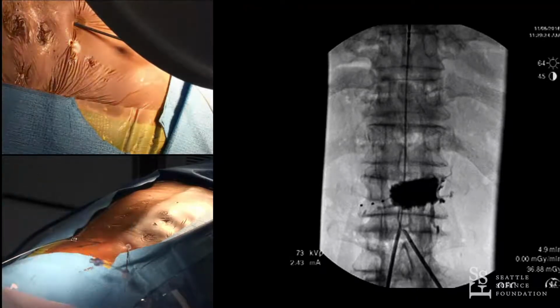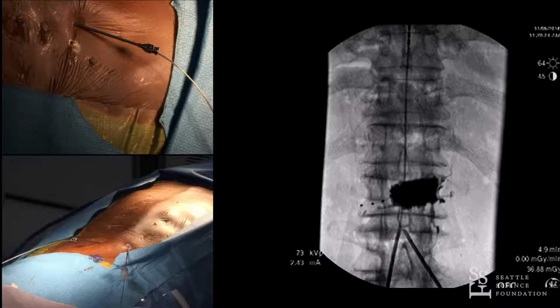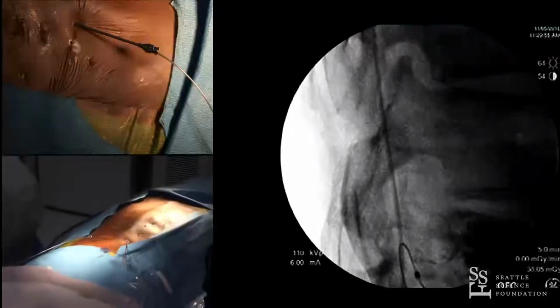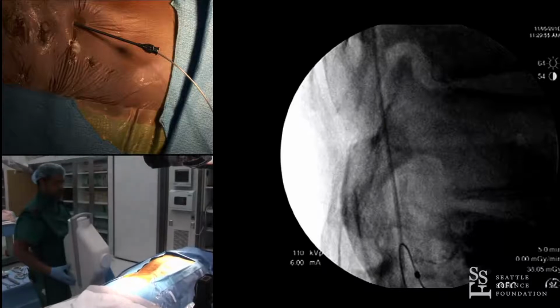Let's take a lateral view now and see what the alignment is of the leads inside of the foramen. Looking to make sure that they are posterior to the vertebral body and that they're aiming more out at us. You can see how, can we mag that, mag 2? Mag again, great, thank you. Come south, please. Tad bit more. Right, there you go.